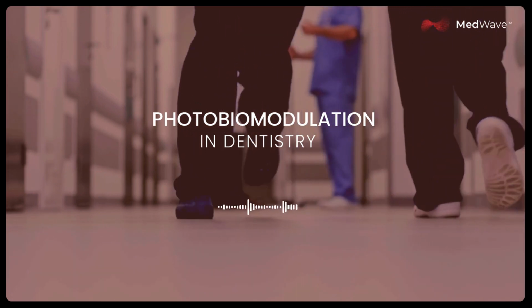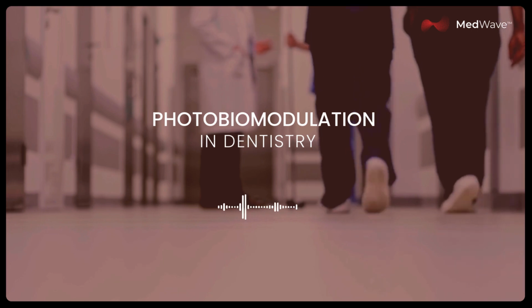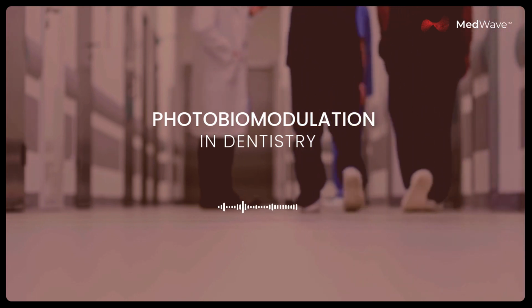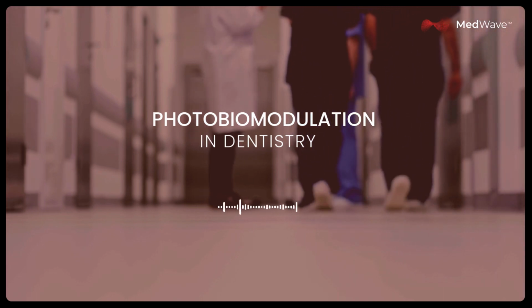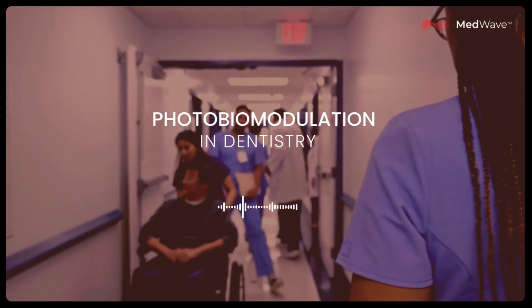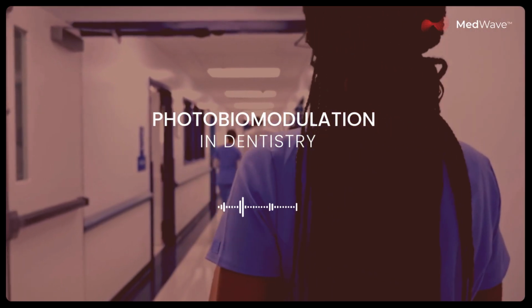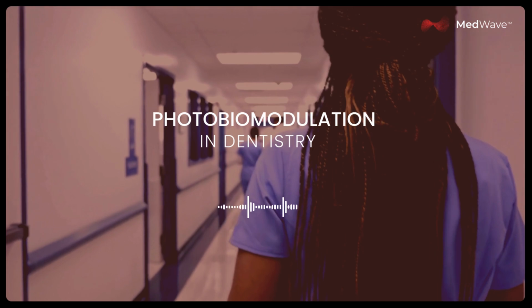Today we're going to be shining a light, literally, on a pretty fascinating area of science that's really been making waves in dentistry. Right. It's called photobiomodulation. Yeah. And you might be thinking, what is that? Well, it's basically using specific wavelengths of light to really help the body heal faster, reduce pain, and tackle inflammation.